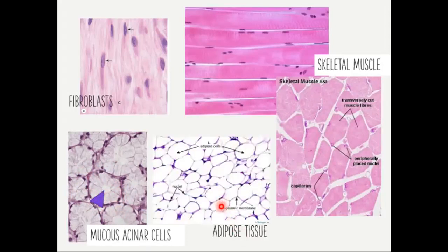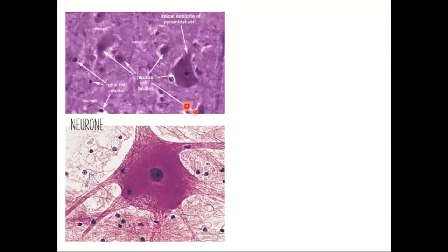And this is an adipose tissue or fat cells. The cell is full of fat, and the nuclei again are pushed towards the periphery. This is nervous tissue. See, the neurons or the nerve cells are star-shaped. They have processes, and they have a big round nucleus, and the nucleolus is also clearly visible. And these supporting cells are comparatively small and scattered around.